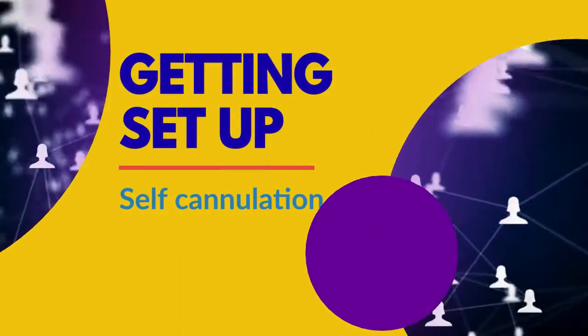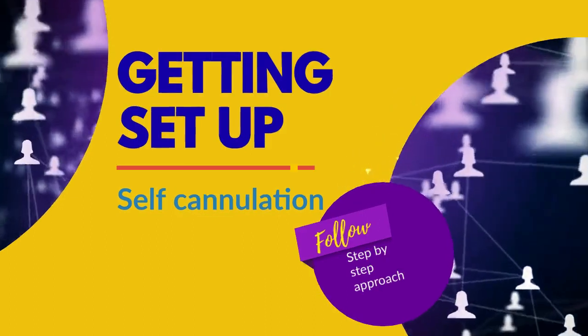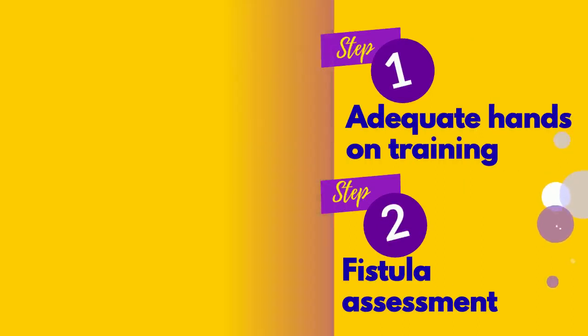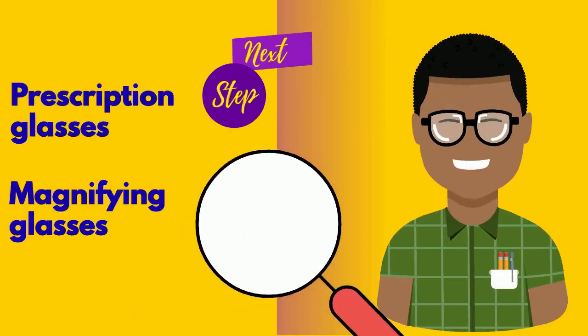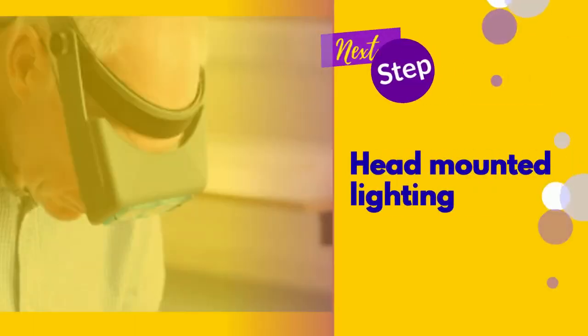Before a patient performs self-cannulation of an AV access, it is important to ensure they have received adequate hands-on training and a good assessment of the fistula has been performed to evaluate access length. Patients are encouraged to use prescription lenses or a magnifying glass if required for vision purposes. Use of head-mounted lighting is recommended for patients that do the dialysis and cannulation without any support at home.